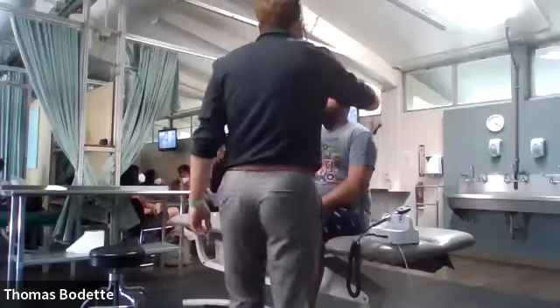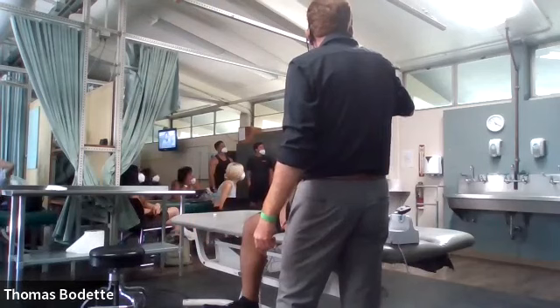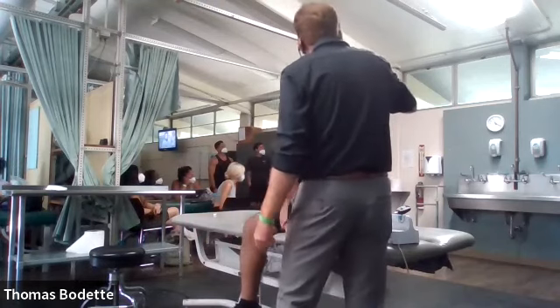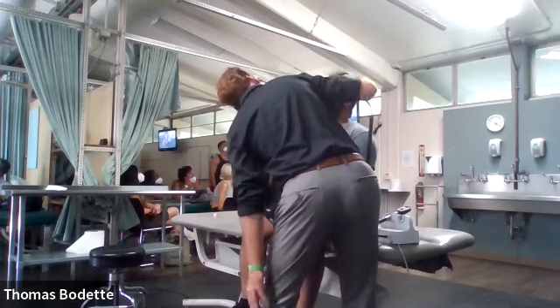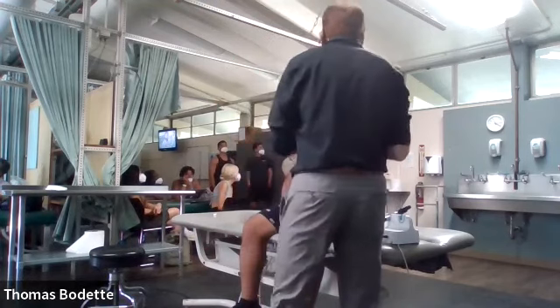Okay, so repeat on the left. Patient seated. We're going to angle the otoscope speculum superior to inferior at the zygomatic process, and you want to inch from medial to lateral. Then have the patient open their mouth and look at the roof of the mouth to see if there's any discoloration. Actually, you know what? I see it. Congratulations.